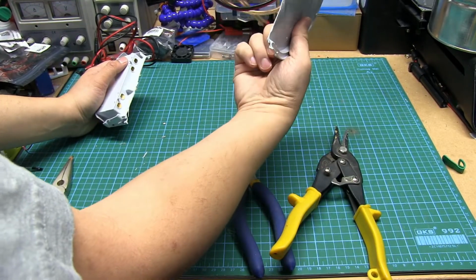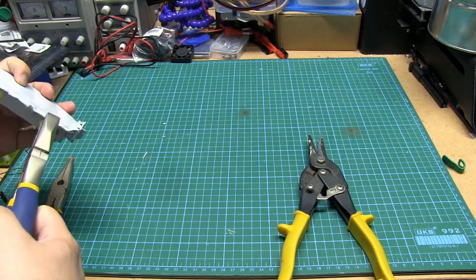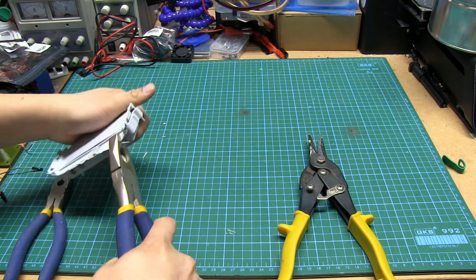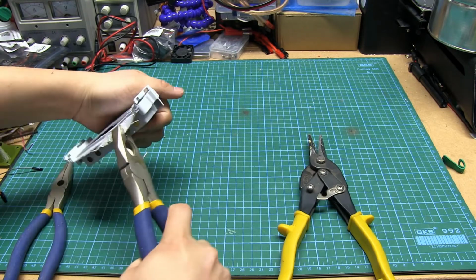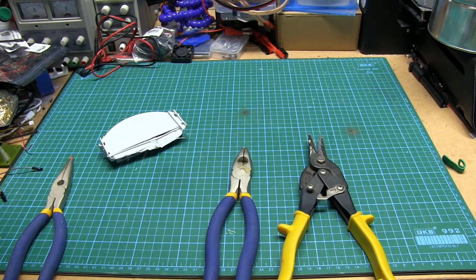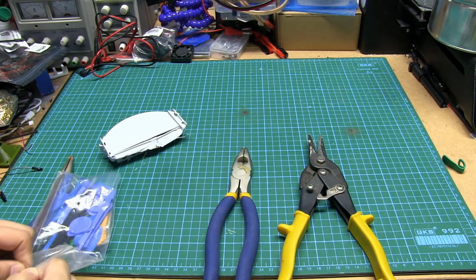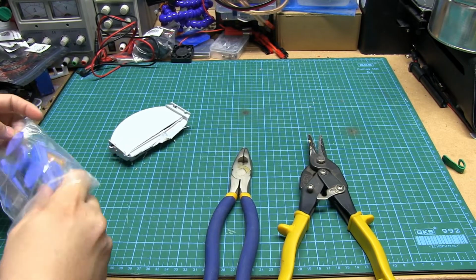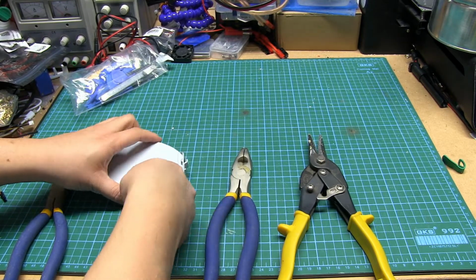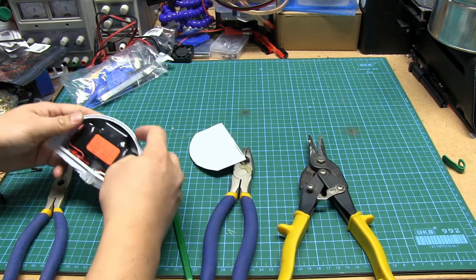And that is just plastic, so that's garbage. Now let's see if I can peel back, starting from the terminals for the... Oh, there we go. Yep. Cracked it open. That makes it easier. Let's get a plastic spudger from our collection of spudgers. Let's try using the green one. Hey, there we go.